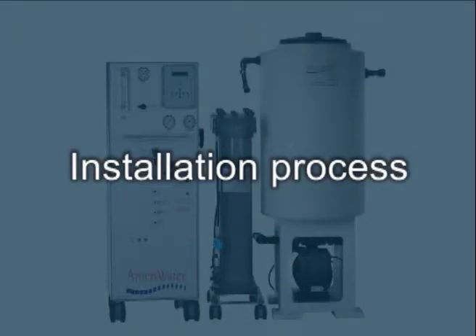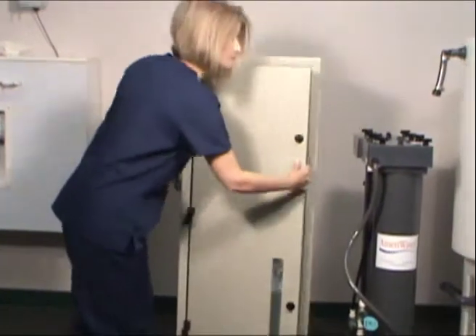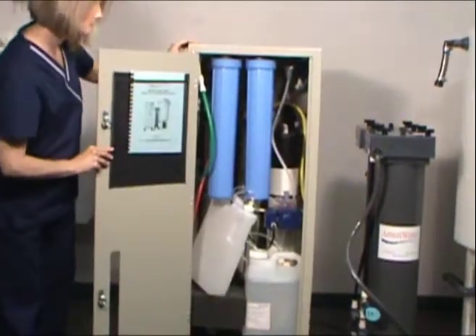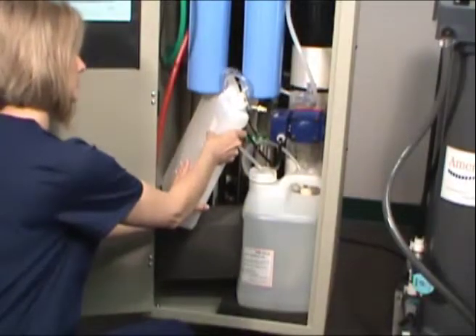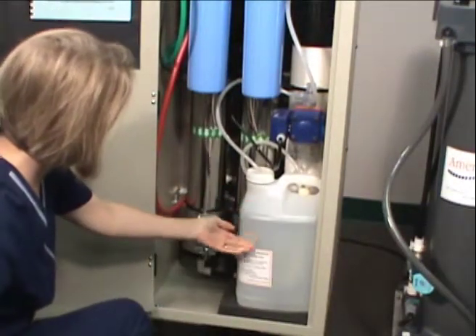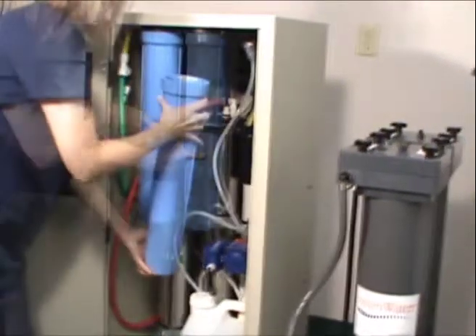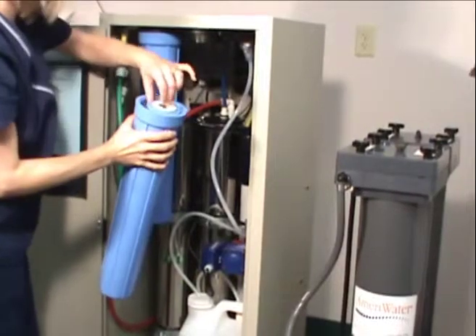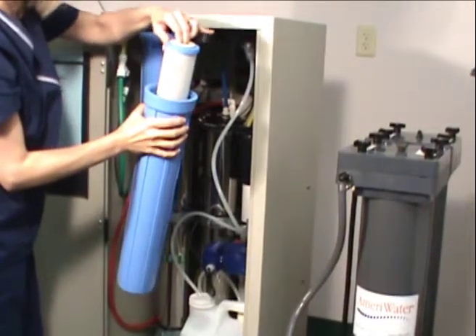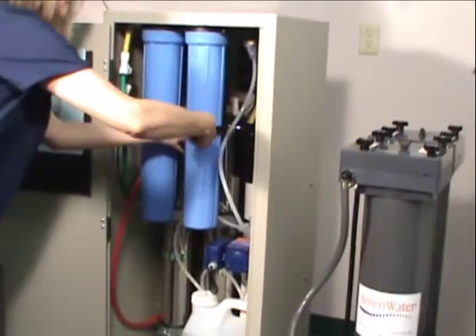Now that you're acquainted with your installation supplies, the installation process can begin. Starting with the RO unit, open the back door to prepare the RO for installation. Remove the PAA container and foam packing. Verify the anti-scalant jug is full. Detach both filter sumps using the special wrench provided and verify the filter cartridges are in place. Once confirmed, reattach the sumps and close the door.